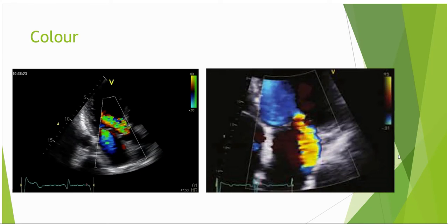The variance can also be applied as just a green overlay to the colour. Regardless of the direction of flow, a green tint is applied. This option is often less desired as turbulent flow blooms in areas of green and detail of flow can be reduced. It is more common that the green is blended to the forward and reverse flow so we can see direction of flow and the amount of variance in the samples.